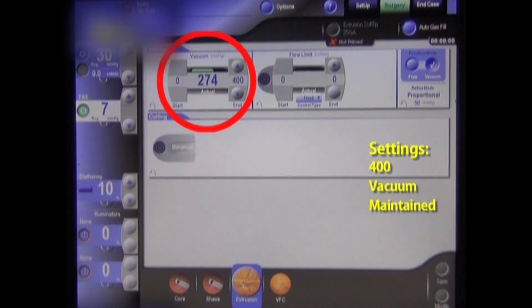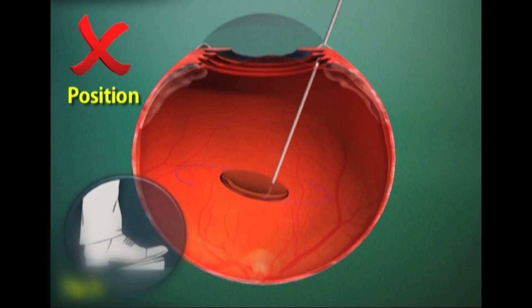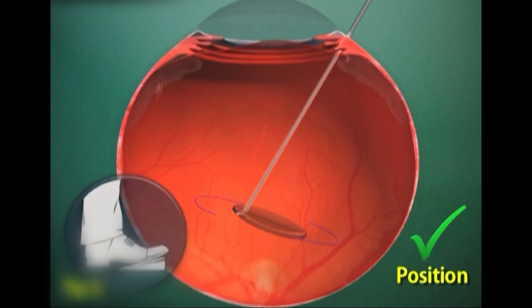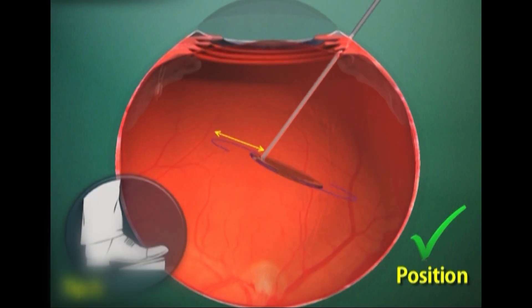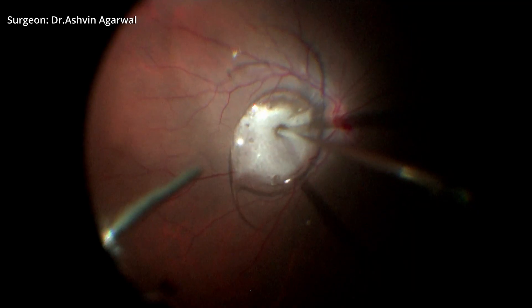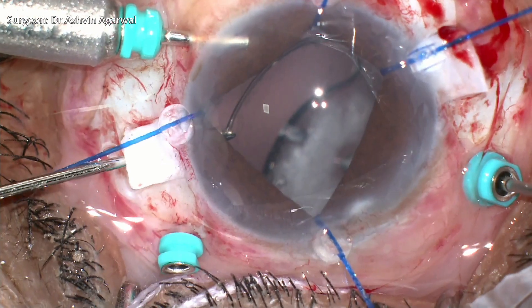The vacuum for vitrectomy is kept between 300 to 400, and the extrusion cannula is then advanced towards the IOL, taking care not to press the suction foot pedal. Once the cannula makes contact with the IOL, the suction foot pedal is pressed and the IOL is gradually lifted up into the pupillary area.